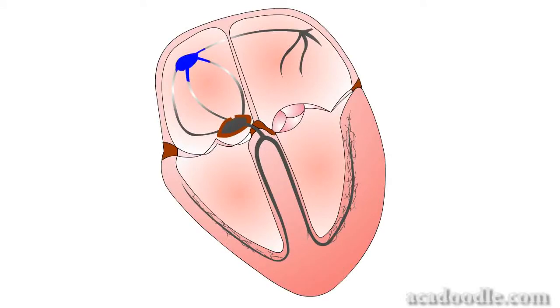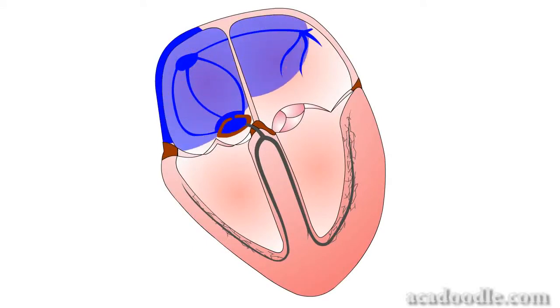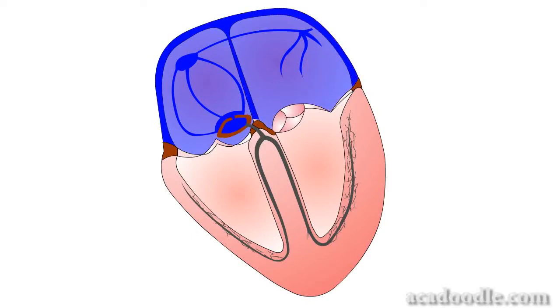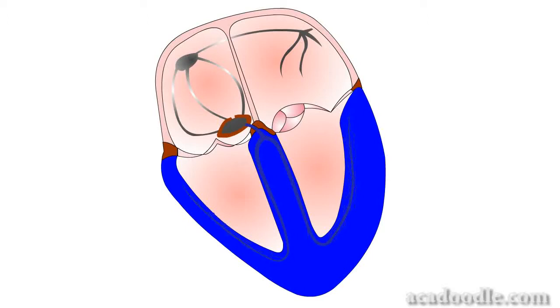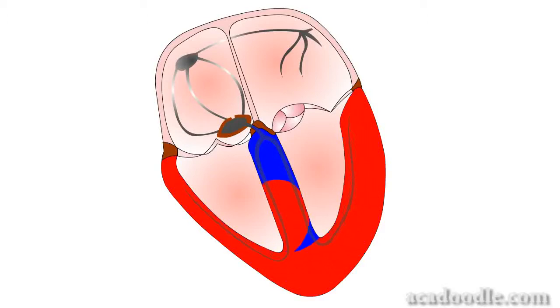Contraction of the atria and ventricles is tightly coordinated by a wave of depolarization spreading through the muscular walls of these chambers. The depolarization wave, seen here in blue, reflects movement of charge across myocyte membranes and is in effect an electrical current spreading through the heart. Following contraction, cardiac muscle returns to a resting state, and this is associated with reversal of the movement of charge across the myocyte membranes. This second wave of electrical activity, seen here in red, is termed cardiac repolarization.